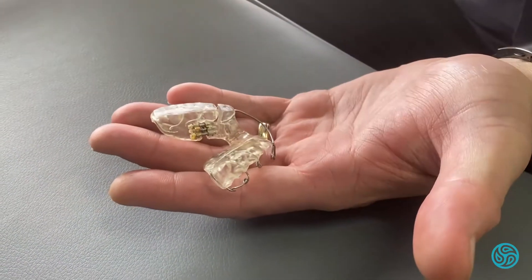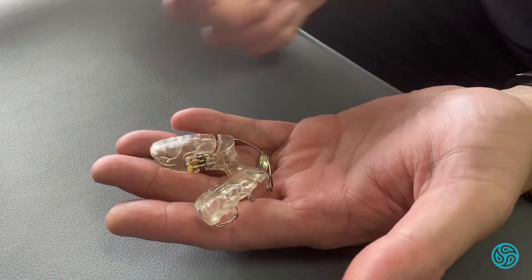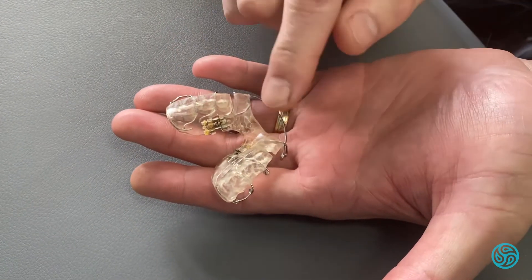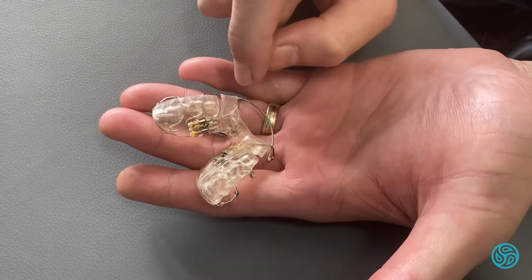We've got a JDA here — a Jaw Development Appliance — that we use to make jaws a little bigger. What I want to run through today is just the adjustment of it. In the first month we don't do any adjustment, just for the patient to get used to it, and then thereafter we need to do some adjustments.